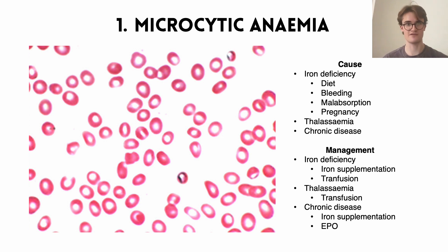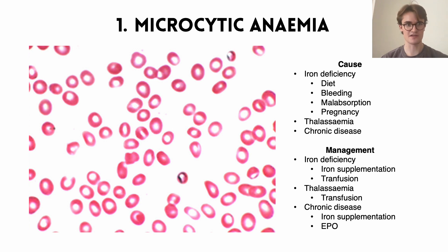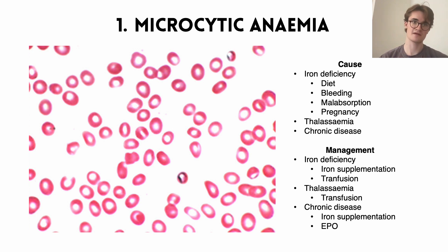Going back to iron deficiency, which is by far the most common cause of microcytic anemia, on the blood smear it can also present with two additional things. The first is anisocytosis — a variation in the sizes of the red blood cells. Looking at this example we can see some that are significantly smaller and some that are larger, instead of all being a very uniform size. The other thing we can see is poikilocytosis — a difference in the shapes or morphologies of the cells. Some look more elongated, and in severe iron deficiency anemia we can even get pencil cells, which are very elongated stick-like red blood cells.